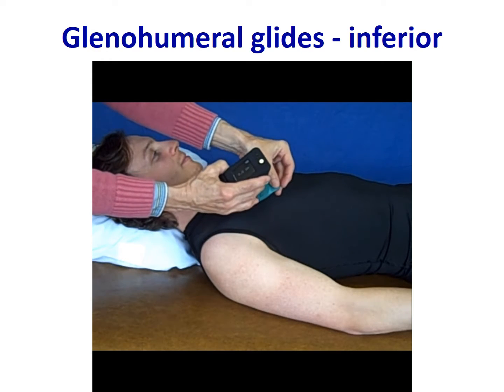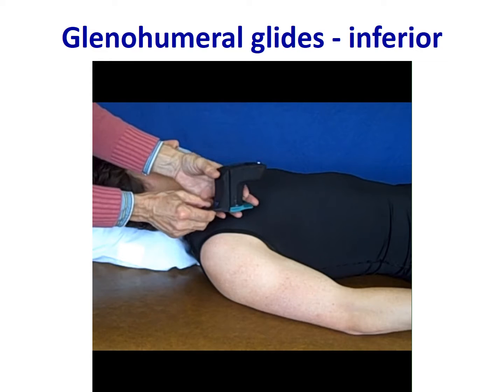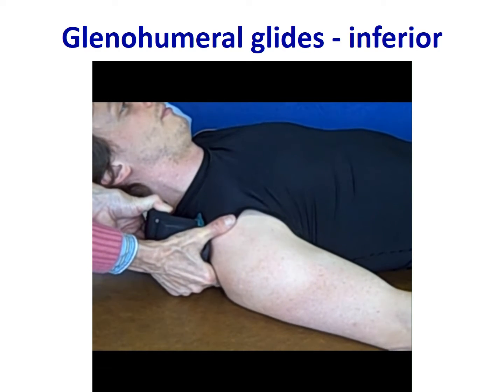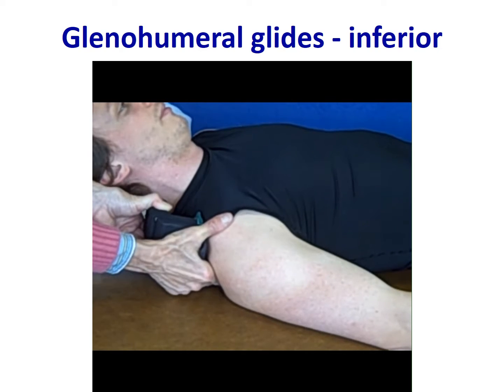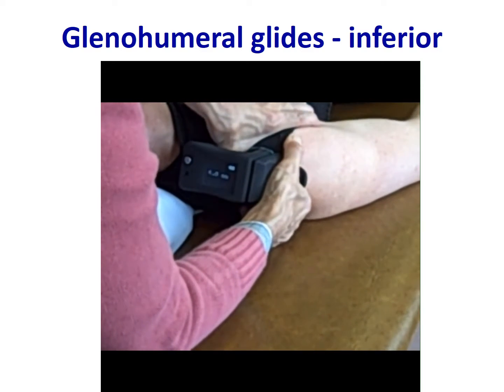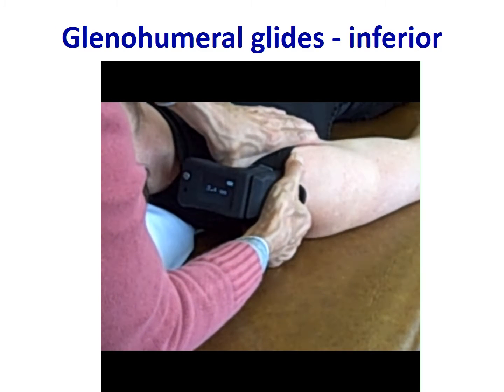Here you see the green attachment, and now the device is lined up with the joint line and an inferior force is directed through the humeral head on the glenoid proximally. The clinician is then able to quantify that joint mobilization — visible from a more proximal angle where you can see the readings on the device. This quantification allows more consistent joint mobilization techniques and ensures you are in the desired range for the grade of mobilization you wish to perform.